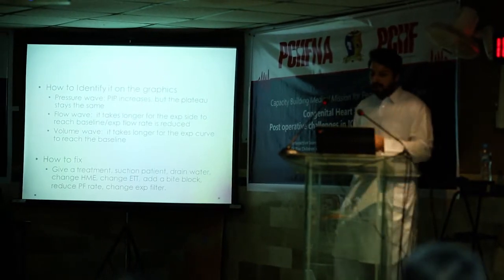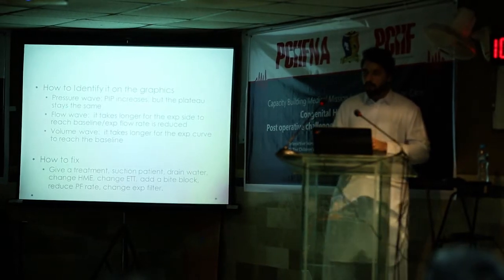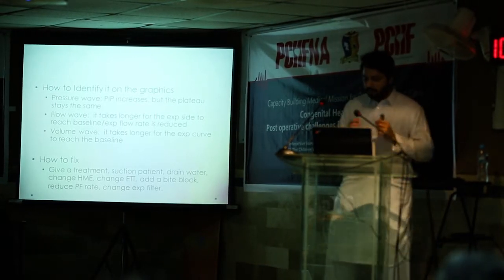So how do we identify it again? By the pressure waveform, flow waveform, and volume waveform. We will check that in the next slides. But how do we fix it?